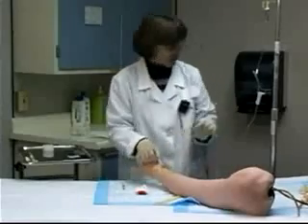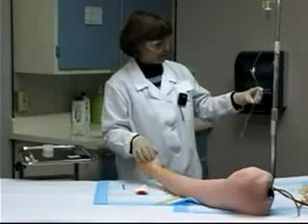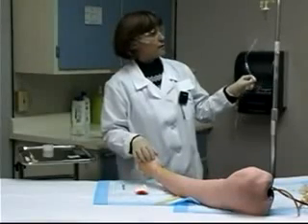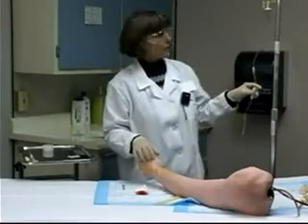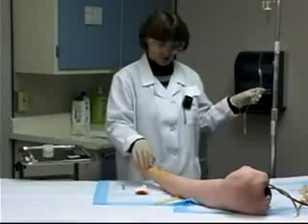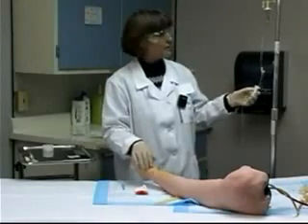Before I cover up my IV, I want to make sure that it's working well. I'm going to do that by two checks. I'm going to open my IV wide open. If it's a good IV, it should be running at a good rate, and there should be no signs of swelling or redness at the site. I'm now going to slow the IV down so I can come back and reset the rate later on.